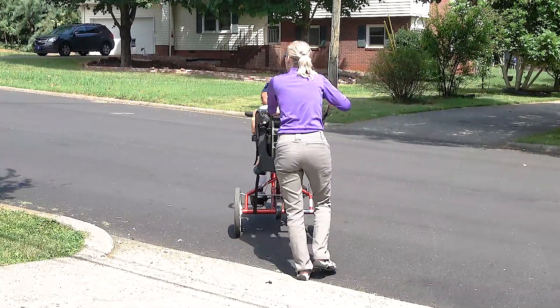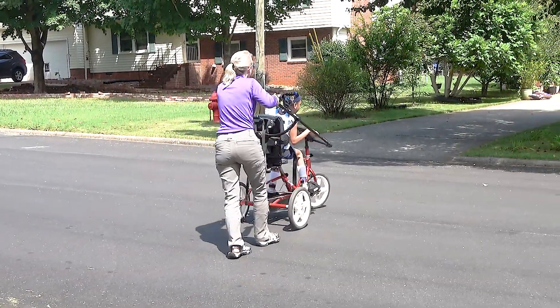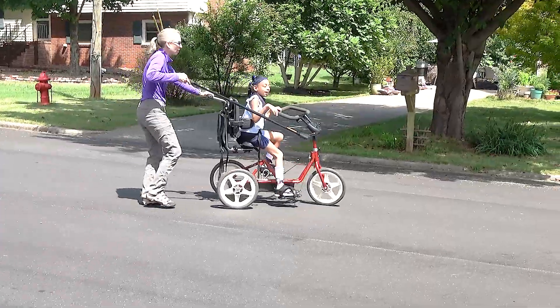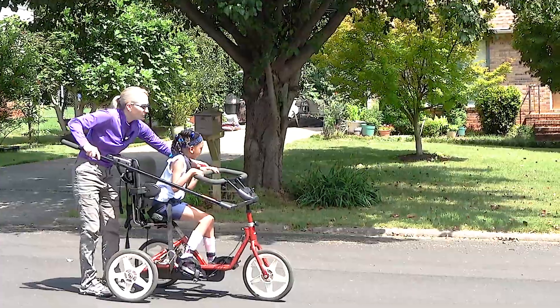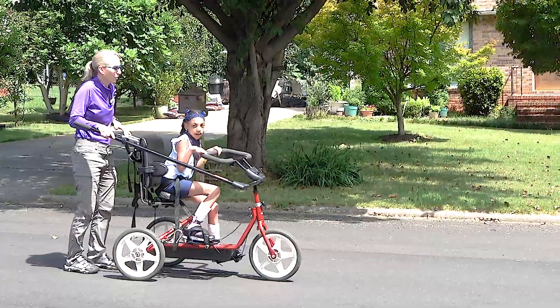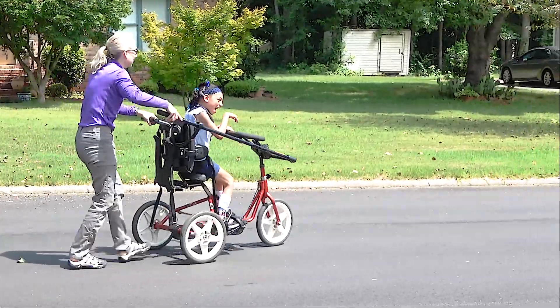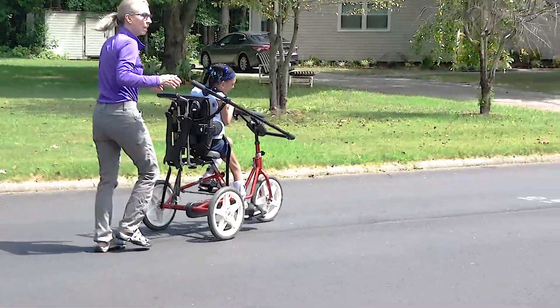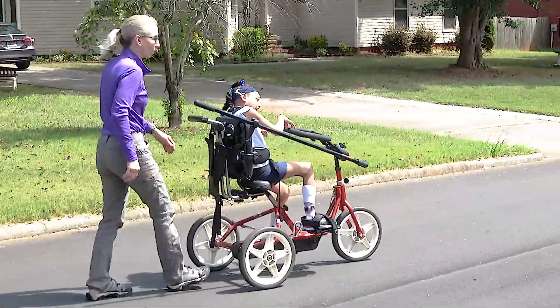We encourage her — she uses her right hand. Alexis, let's go right so everybody can see us better. Alexis, are you holding on? We can't go. Get both hands on. Alexis, can you show them how you can pedal all by yourself? This is clearly exciting. The more movement she gets, the harder it is for her to hold on with her hands.